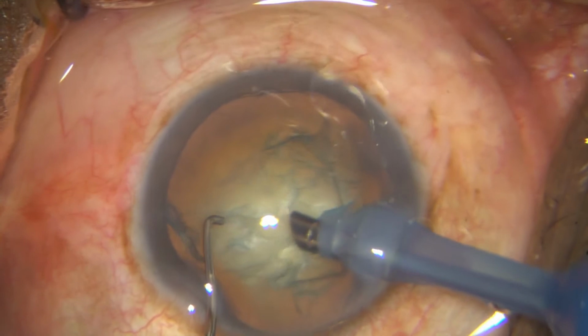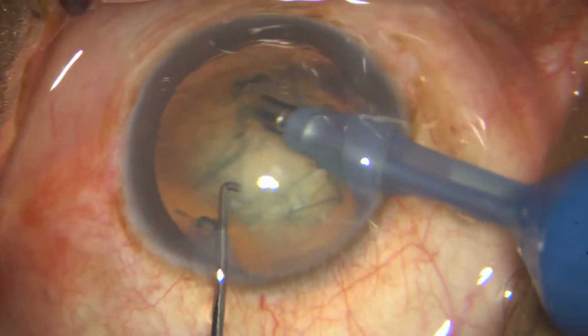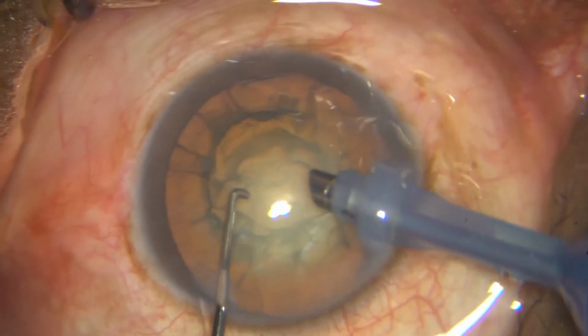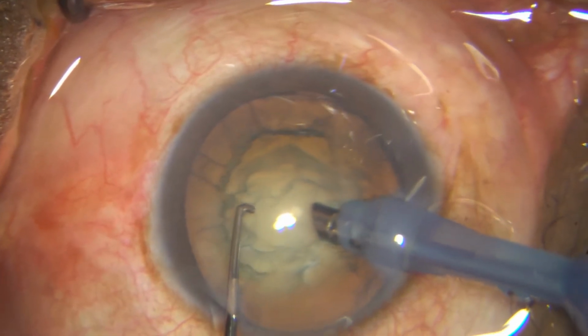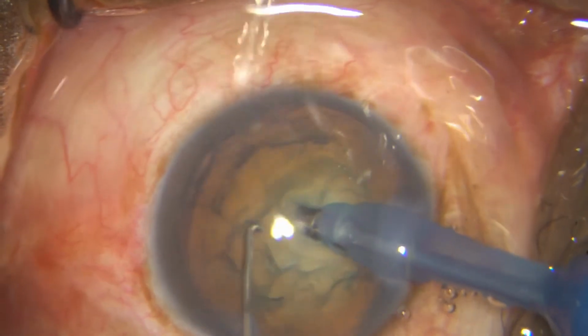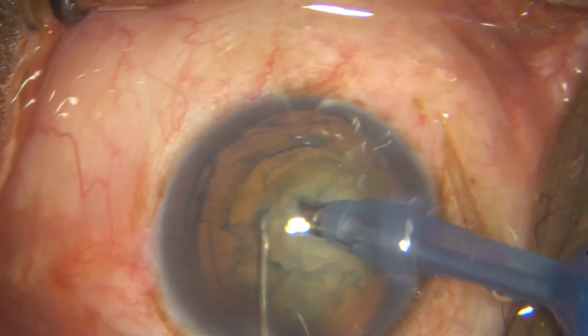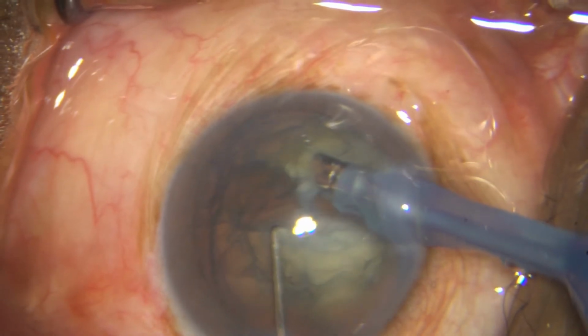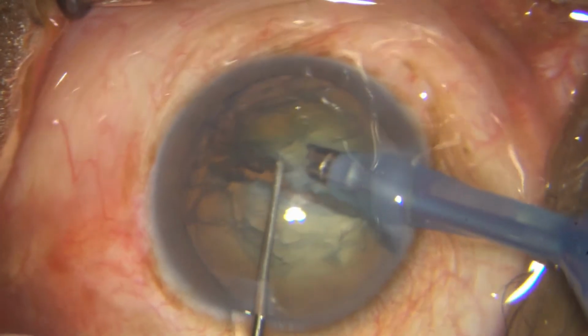And since it's not that great a cataract, I'm just taking a dialer in my left hand as a chopper. Take my phaco 2.8 phaco in my right, and I'm going to do the quick chop method or the direct vertical chop method. And that's a good chop. You can see the posterior capsule all the way through.